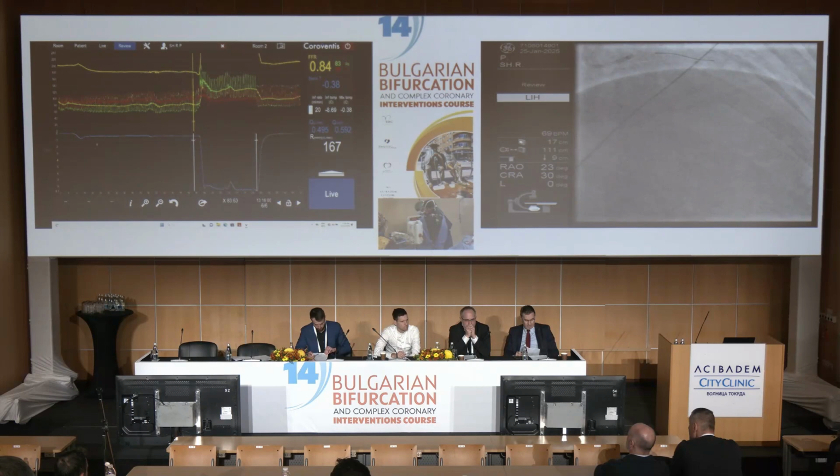And then there is a small detail which is so elegant, I cannot resist. Here, the pump is already giving 20 milliliter per minute. But the system is not yet fully vasodilated. And this is the reason why the temperature goes down even lower and then comes back. This square root sign is the proof that before you were at rest and afterwards here you are hyperemic.